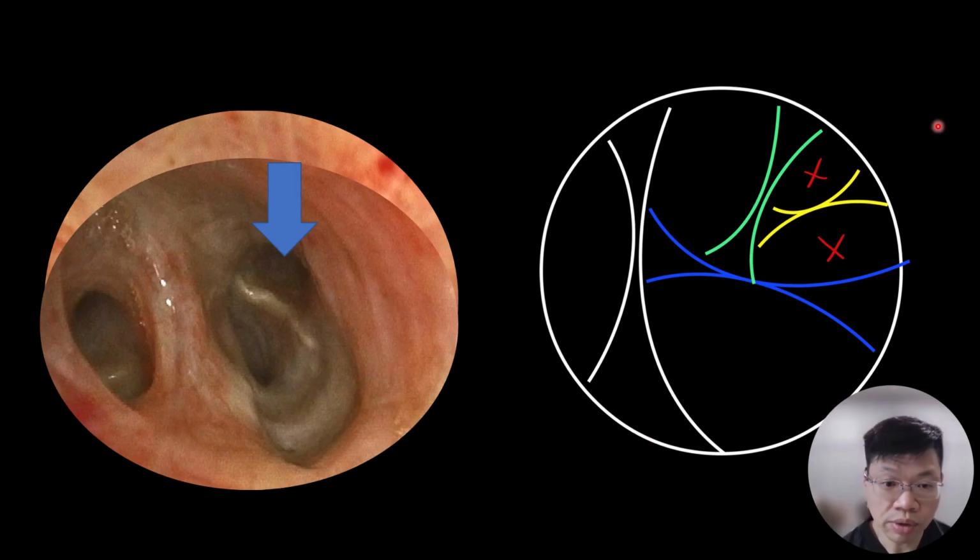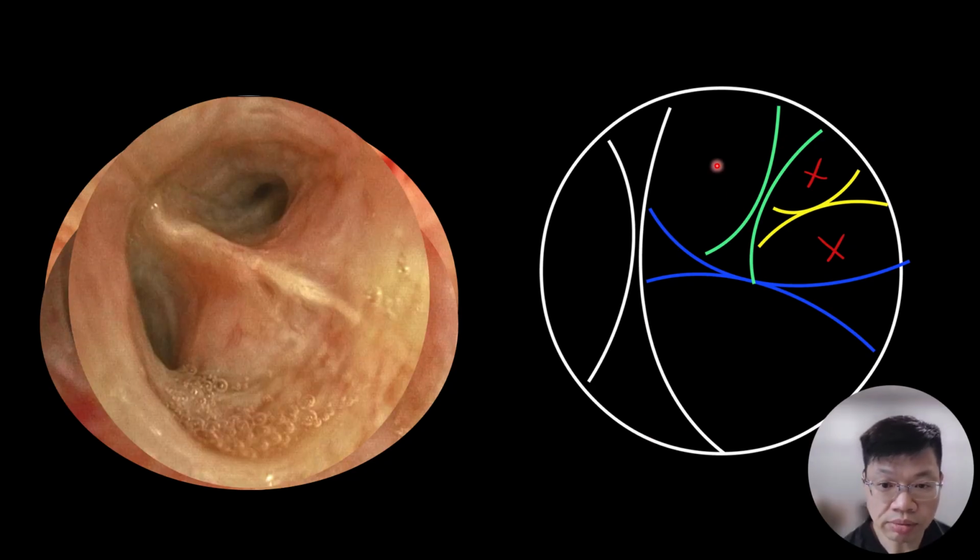Following the right hole, we can already see that it will split up and down in this configuration that we can draw. And following the up hole, we can see that it splits left and right, which is the configuration we have drawn. At this point, because we're using a bigger scope, we're unable to pass the scope in any further, but that doesn't really matter as long as we enter this hole on the right. As we know, the subsequent split inside will both lead to the nodule.